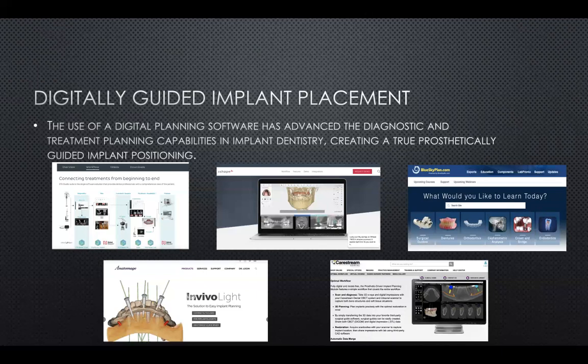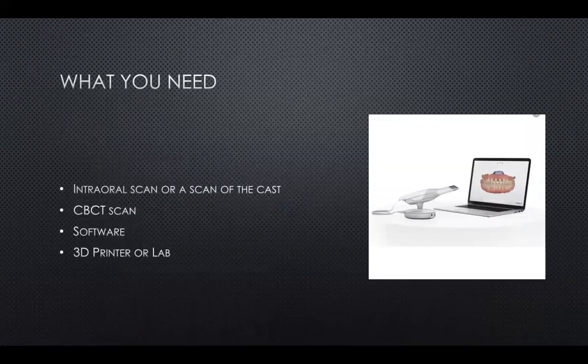They share almost the same components, and this is called digitally guided implant placement, where you can upload your intraoral scan and CT scan, and plan your implant accordingly. So let's take a look at how it's going to look using one of these systems.